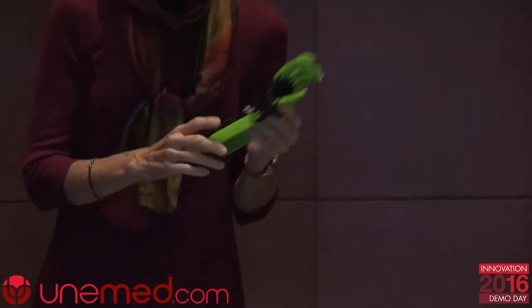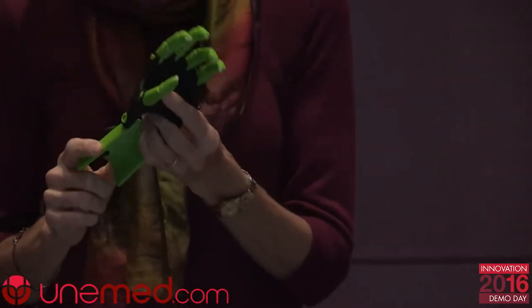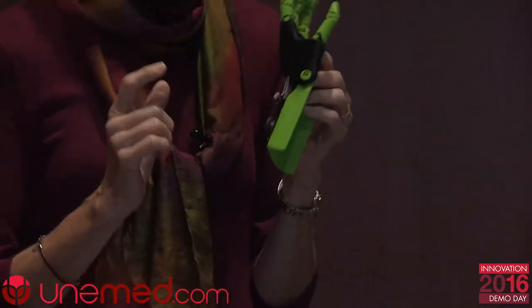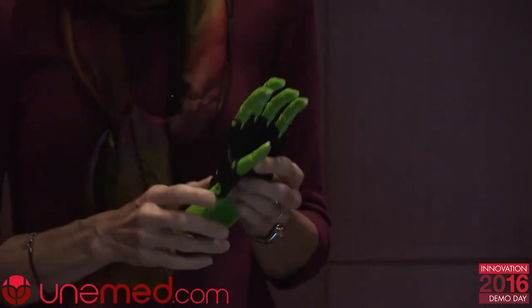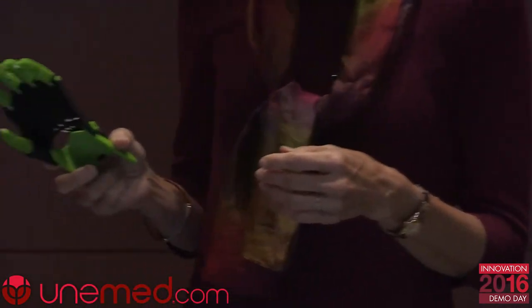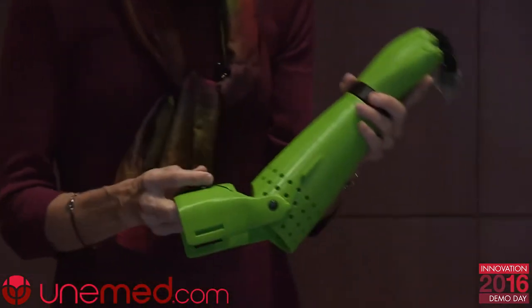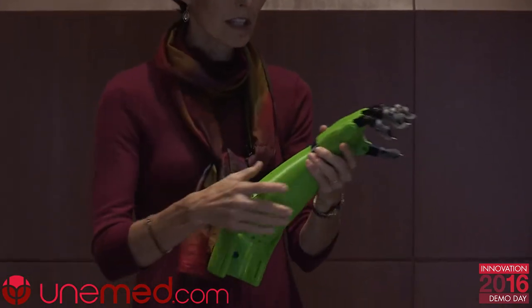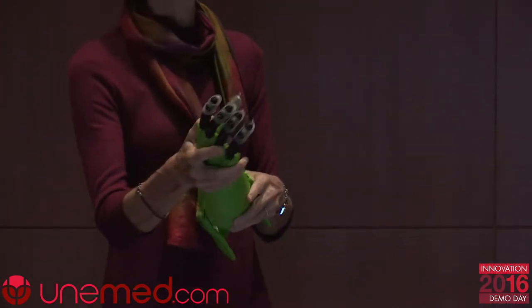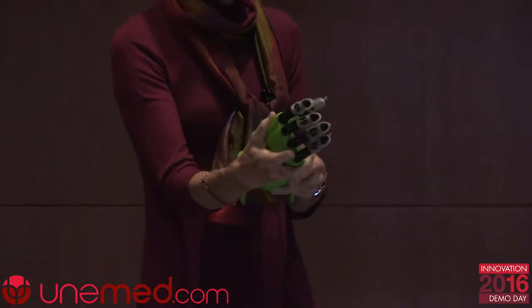These devices come in a multitude of colors, including glow-in-the-dark. We have never had a child request a skin tone device yet. After doing this for a while, we realized that many of our children have trans-radial reductions, so we came up with an elbow-driven device. Rather than wrist-driven, elbow flexion produces finger flexion. It also has a component to provide pronation and supination, so they can adjust that for whatever activity they're completing.